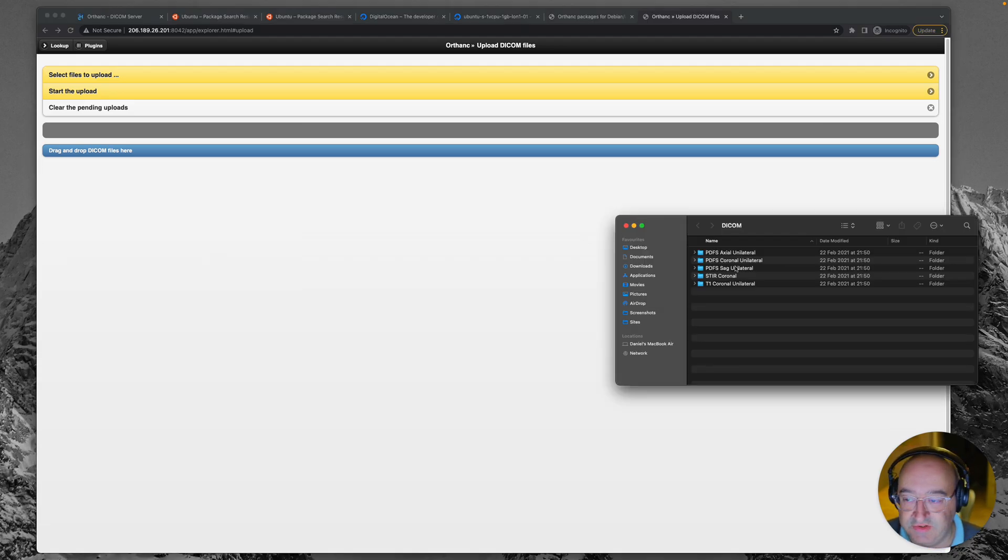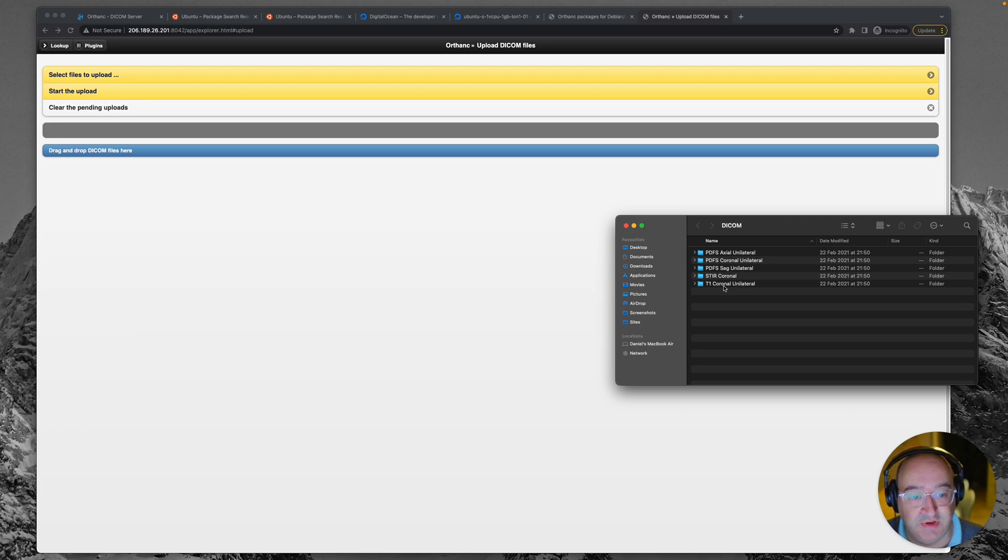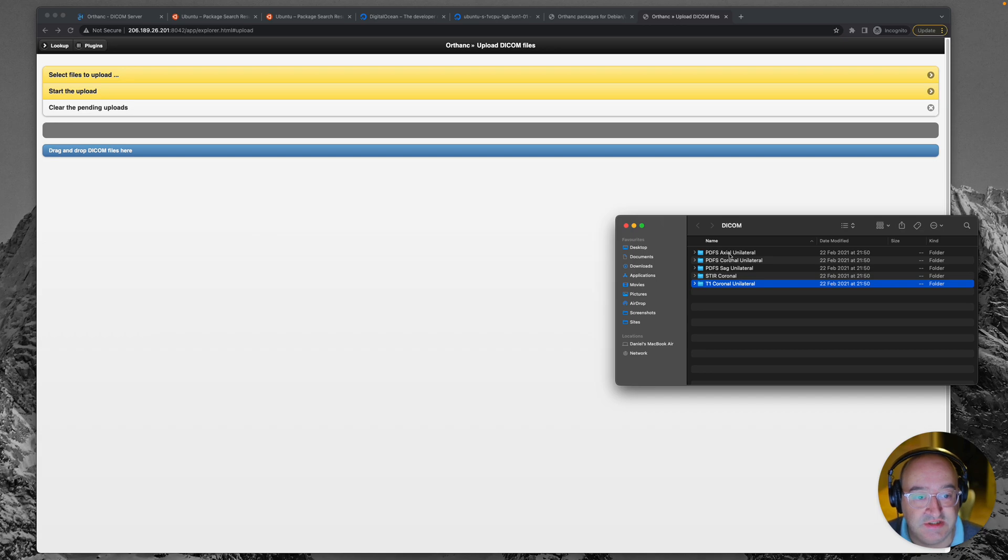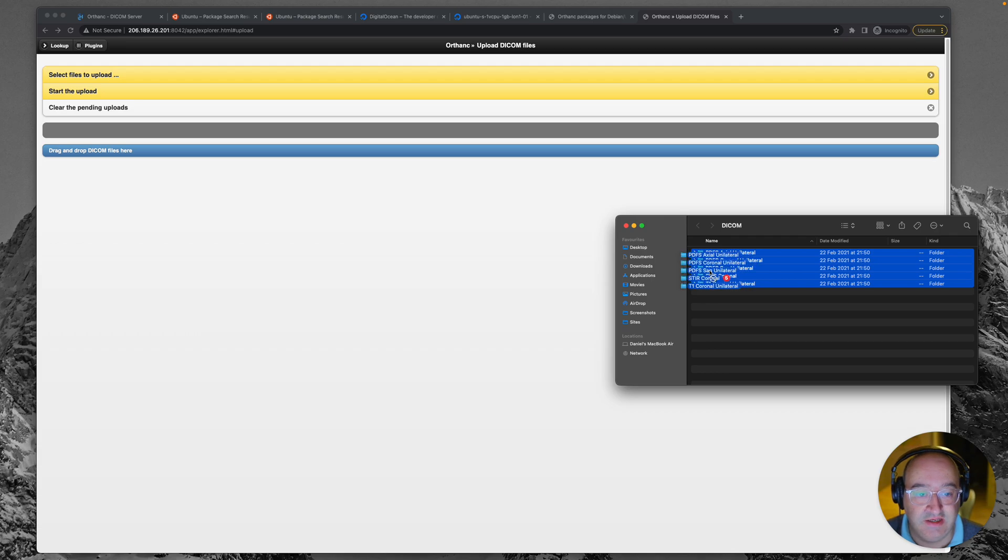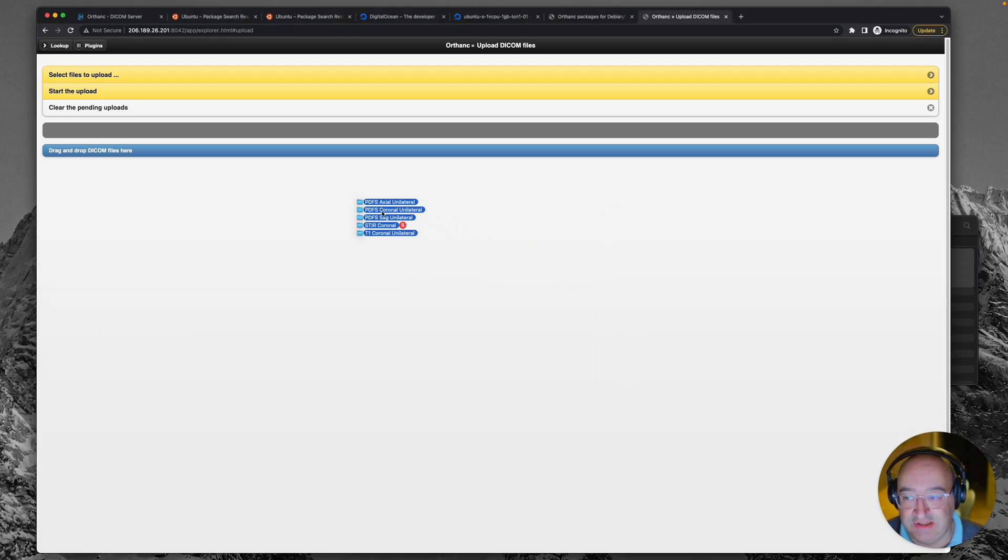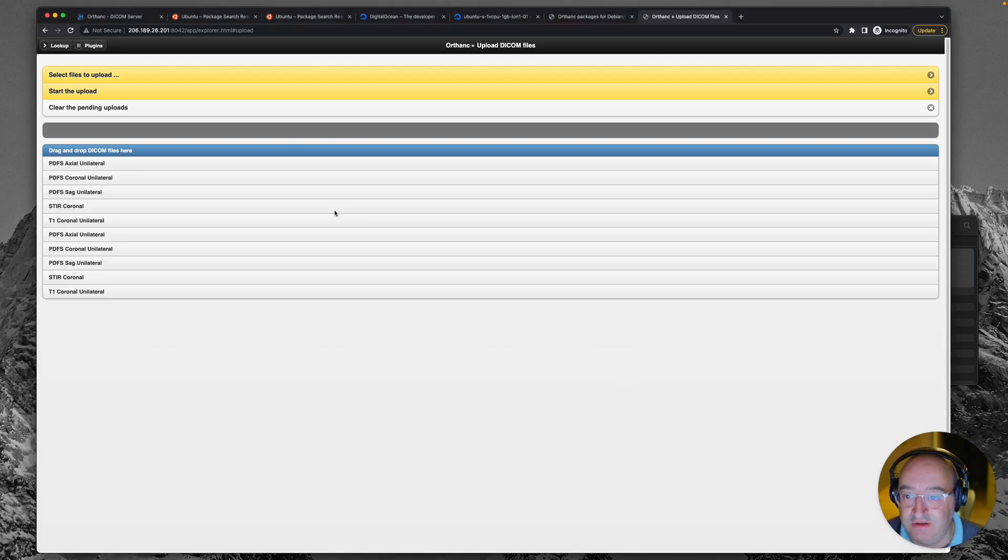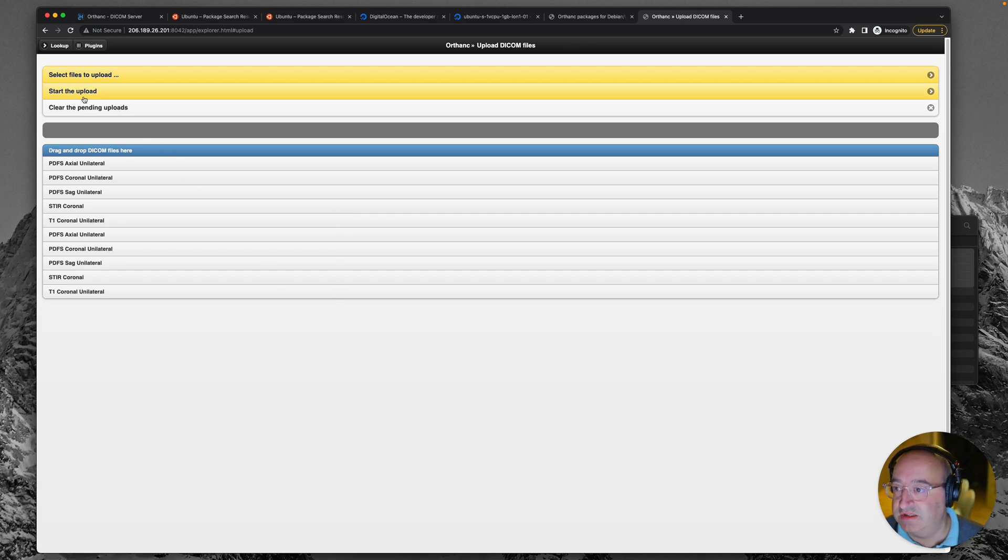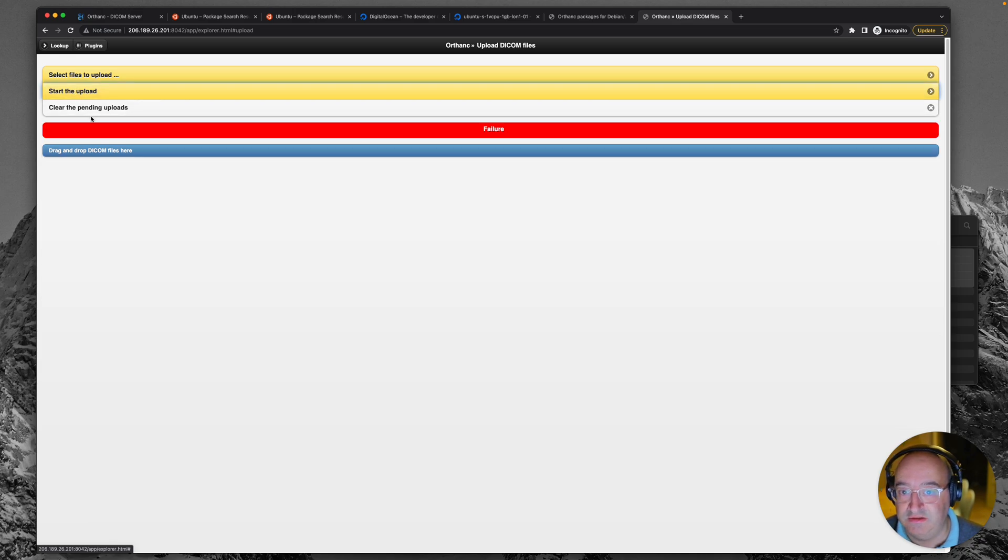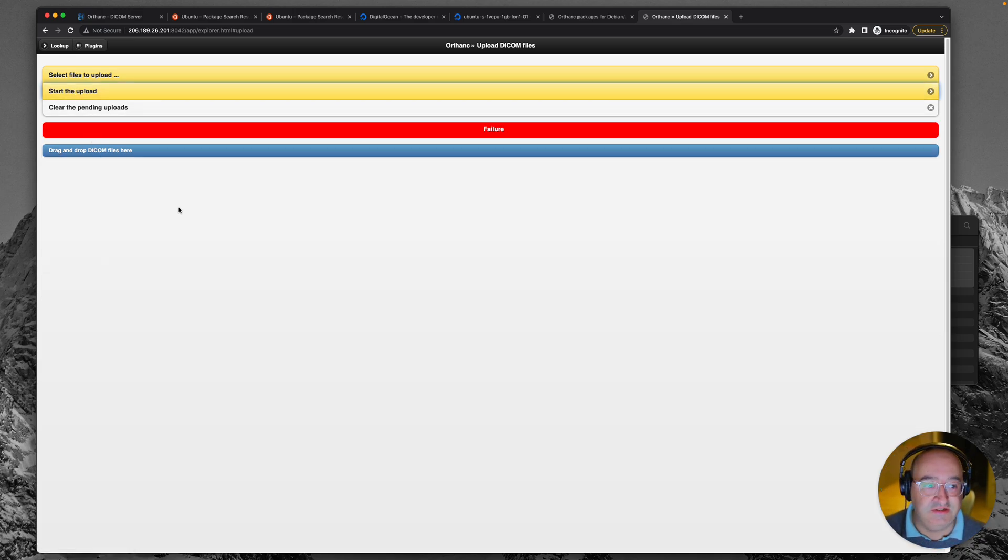So I've just opened a folder with some anonymized DICOM images here, which we're going to try and upload. So I'm going to just highlight all of these different subfolders, which are different series and click and drag them across. And you'll see that little plus icon and that looks promising. So let's click start upload. Oh no, failure, instant failure. Not great.